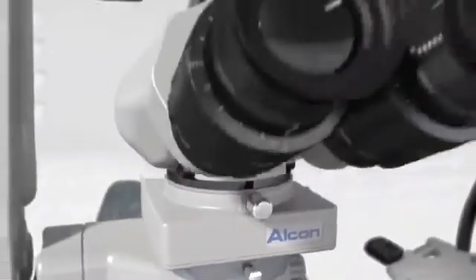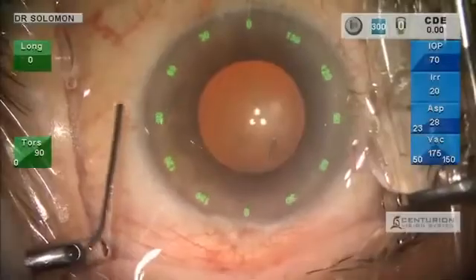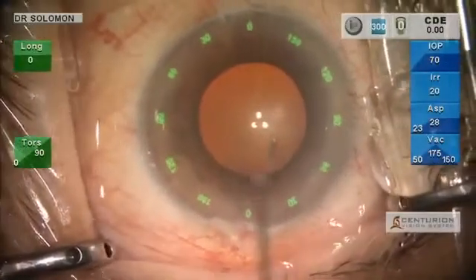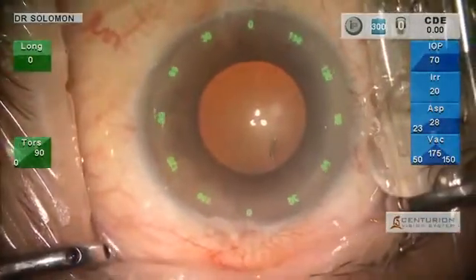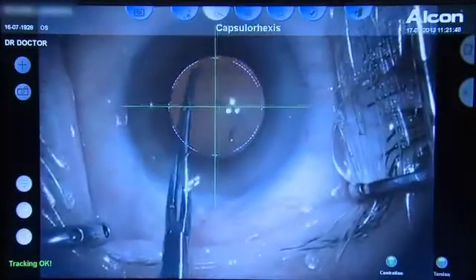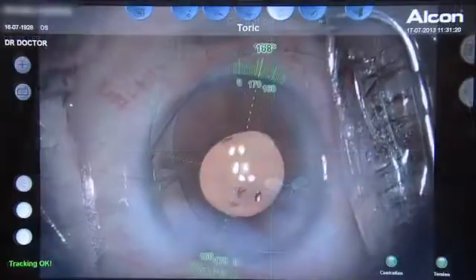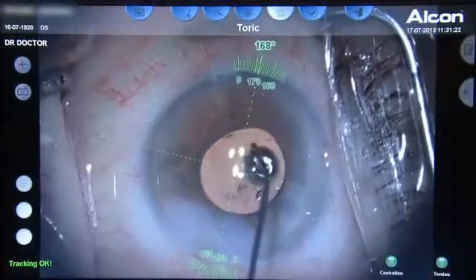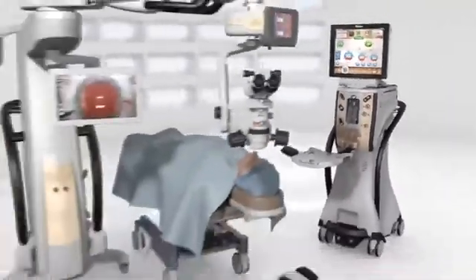These computer-generated overlays offer a new measure of consistency and control for every surgical step of the procedure, including an incision guide, capsular axis guide, centration guide for multifocal IOL positioning, and toric alignment guide for lens positioning.